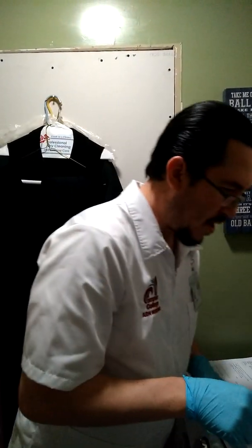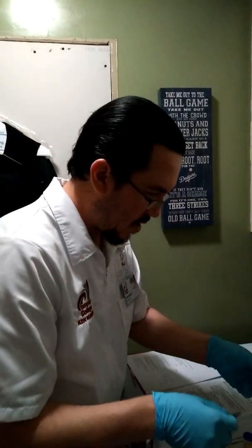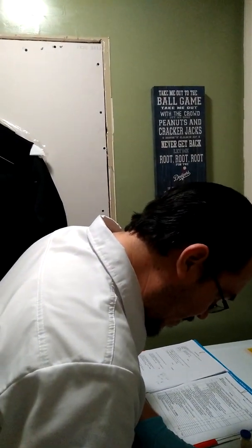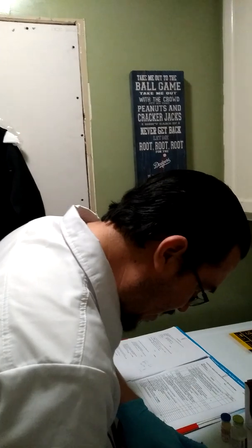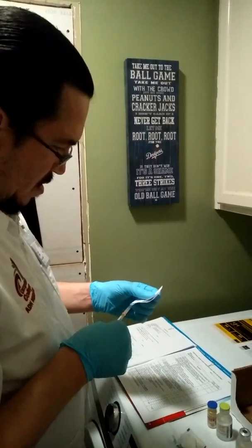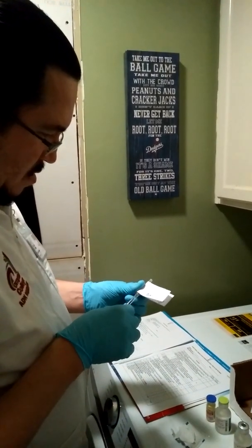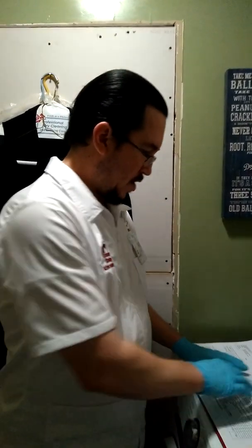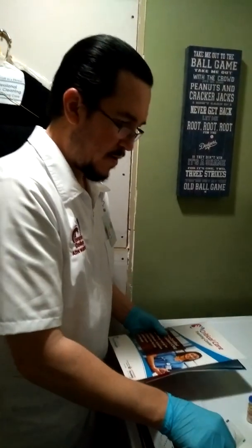Next, now I have to make sure I write down the name on the syringe, the medication, so I won't get confused. So 0.5 ml Fluzone quadrivalent. Put it on the syringe. Okay, it's ready. So next I have to go talk to the patient. Take my MAR and the syringe and alcohol prep pad to clean the site. So let's go over there.